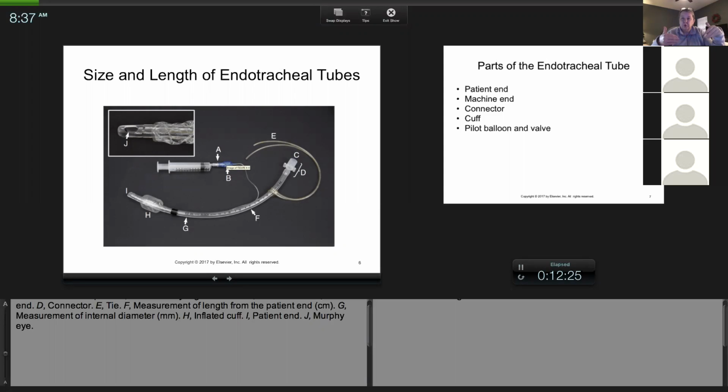I will have tubes in here that last day we meet in week 8, and I'll have syringes. You guys can practice filling these cuffs, so you can get the practice, because there's a special way to do it that I just explained.